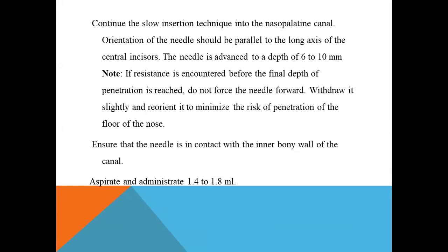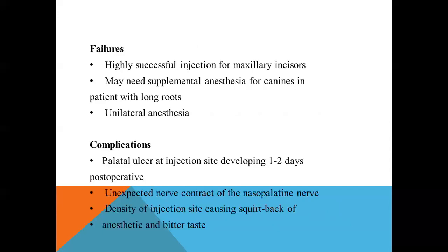Note that if any resistance is encountered before the final depth of penetration is reached, do not force it further. Withdraw it slightly and reorient it to minimize the risk of penetration. Make sure that the needle is in contact with the inner wall of the canal. Aspirate and administer a sufficient amount of anesthesia.